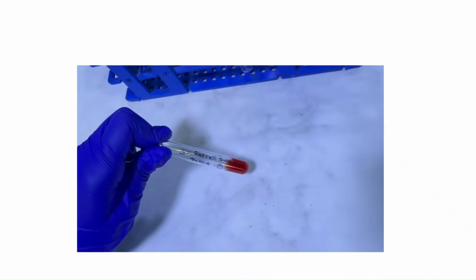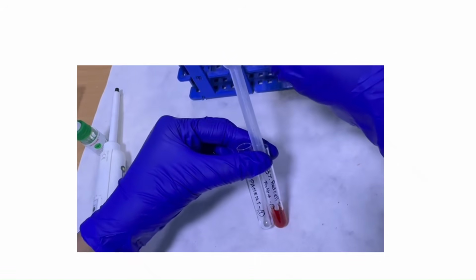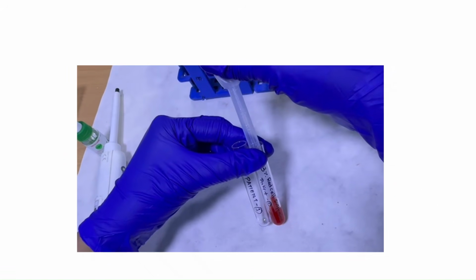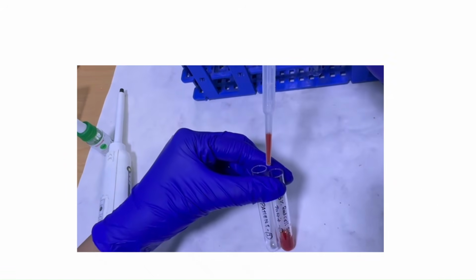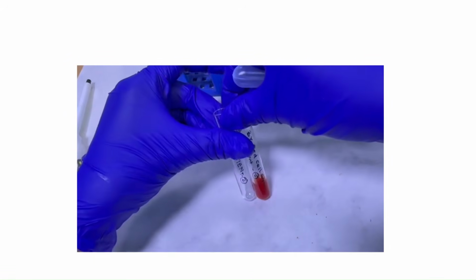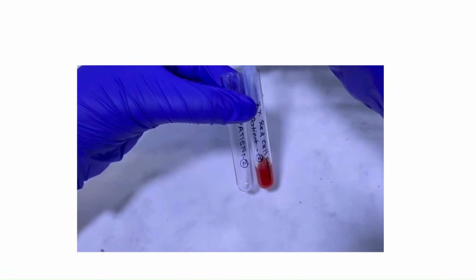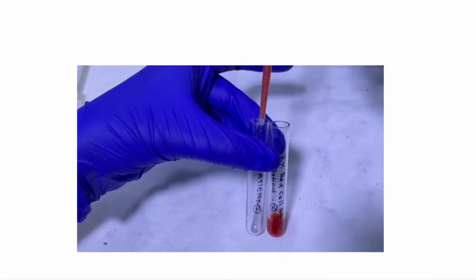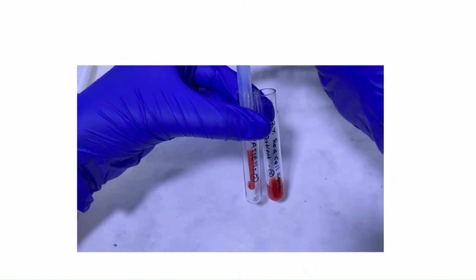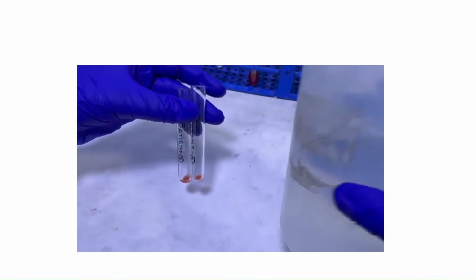Now moving on to the test. With the help of the 3% red cell suspension, take a clean labeled test tube for the test, label it as patient 1, and place 1 drop of 3% red cell suspension of patient 1. Similarly for patient 2, take a clean labeled test tube, label it as patient 2, and drop 3% red cell suspension into the test tube.